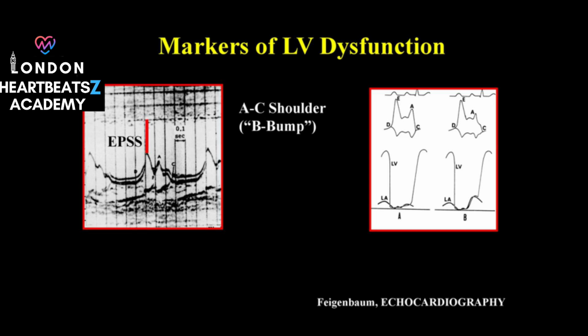Precisely. And it doesn't stop there. M-mode is also extremely useful in diagnosing atrial septal defects, or ASDs. I've heard of ASDs. Can you remind me what they are? Certainly. An ASD is essentially a hole in the wall that separates the heart's two upper chambers, the atria. When this hole is large, it can cause a significant amount of blood to flow from the left atrium to the right atrium, which is the opposite of what should be happening.